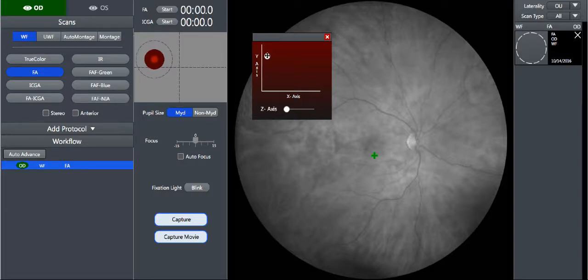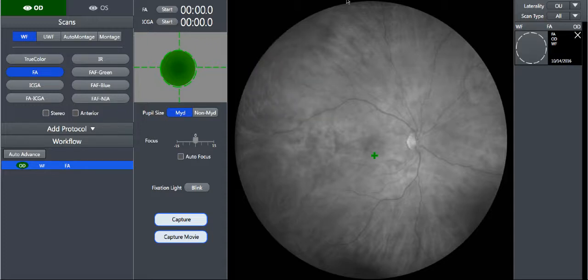So as the user, my goal is to move the camera so that the eye lines up with the axis guides. You can see here, I got within the acceptable range on the y-axis, so it turned green. Now I do the same thing for the x-axis, so both indicators are green. But I'm not close enough to the eye, so I'm going to move the camera forward until the z-axis guide turns green, and when all three axes are green, the eye illustration also turns green, letting me know that I'm fully aligned and ready to capture my image.